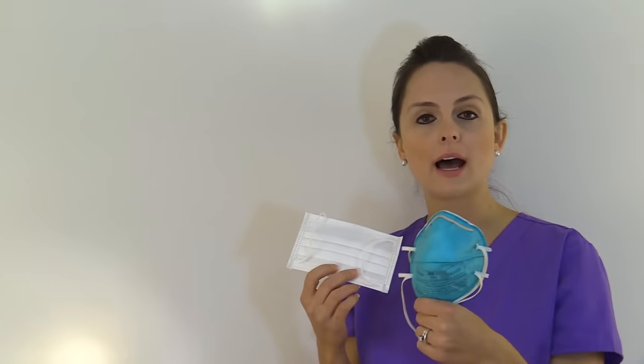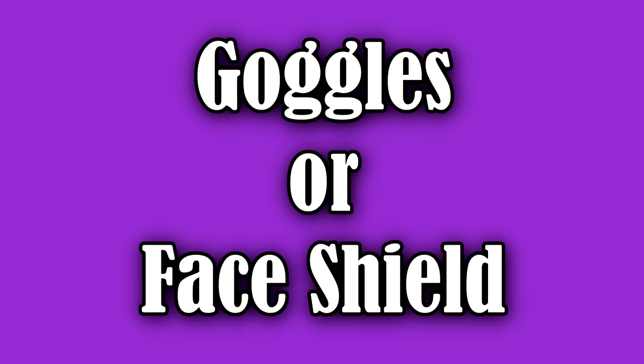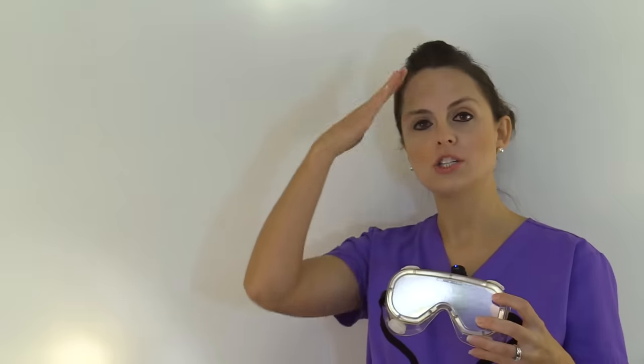This mask will help protect you from the droplet nuclei that those diseases produce. So you'll select whichever one you need based on what you're going to be doing. Next, goggles or a face shield will protect your eyes from any potential splashes of blood or mucus. Select accordingly whatever you have access to — standard goggles or a face mask with a shield attached.